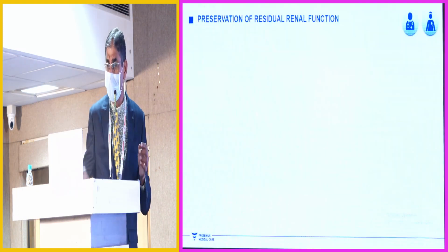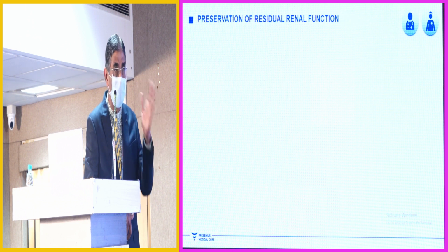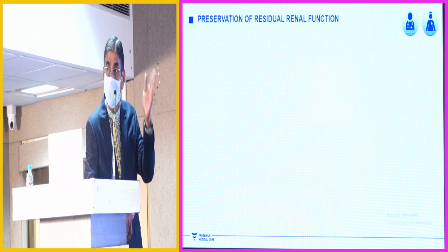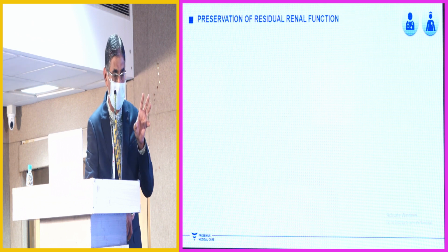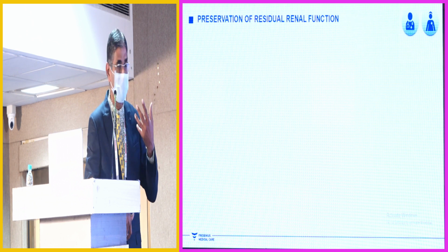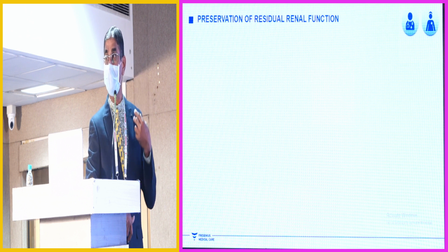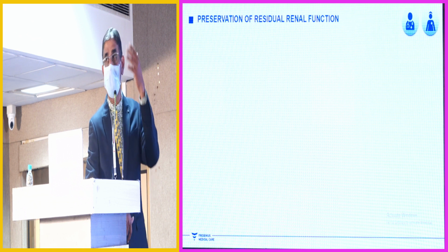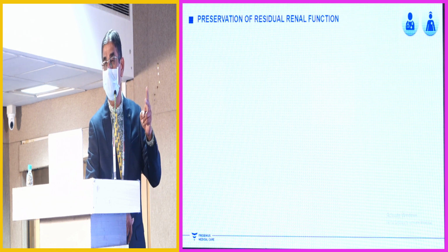You need to see that the RO system, which has the sediment filters, is backwashed frequently every day, at least half an hour of rinse and half an hour of backwash, followed by the regeneration of the softeners. Normally, when I have traveled and walked through almost 3,900 hospitals in India, and I ask how many times they do the regeneration, they say once a week, twice a week, nothing like that.